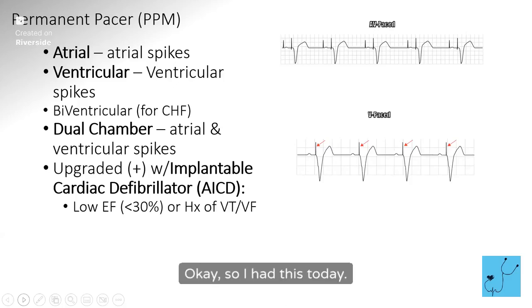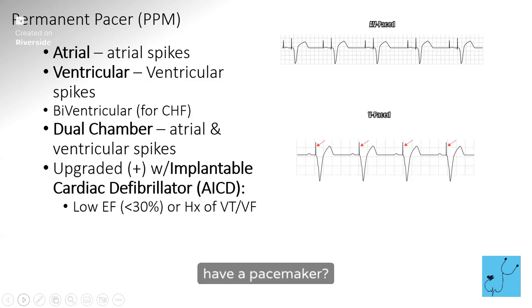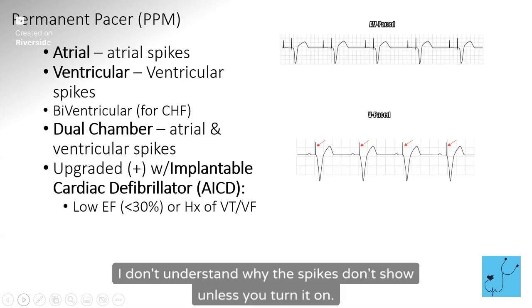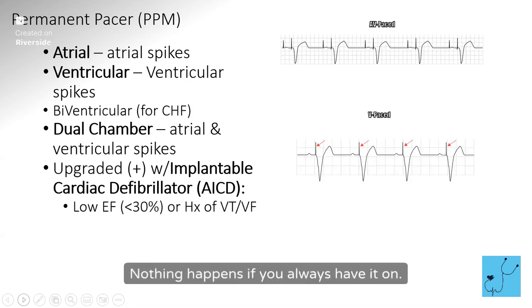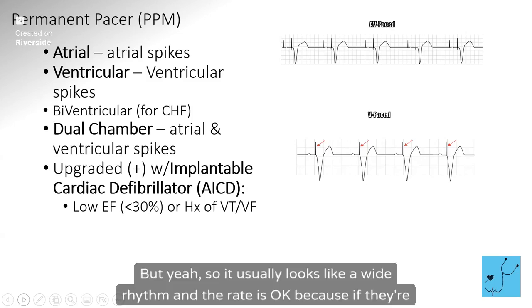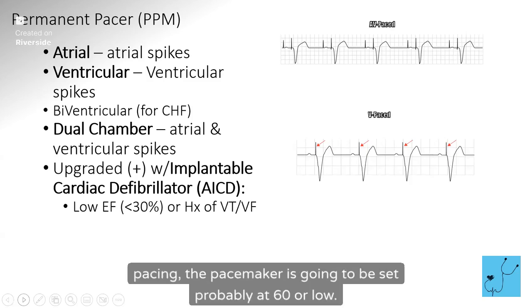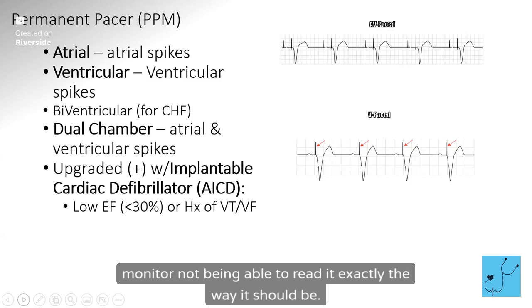I had this today. I had this rhythm without the spikes, and I was like, ew. So I asked the nurse, do they have a pacemaker? She says yeah. So I turn it on, pace 2, and there's my little spikes. I don't understand why the spikes don't show unless you turn it on. If you always have it on, the monitor might get a little confused. It might show you some artifact, but it's not going to hurt anything. It usually looks like a wide rhythm, and the rate is okay, because the pacemaker is probably set at 60 or above. It might dip a little, 59 and then 61, and that's just the monitor not being able to read it exactly the way it should.